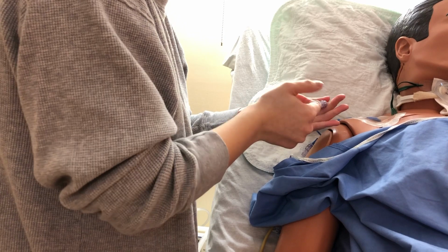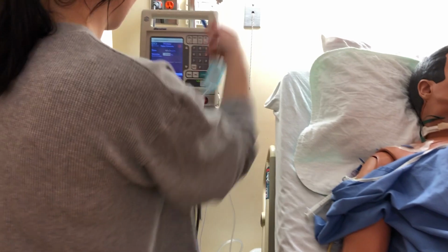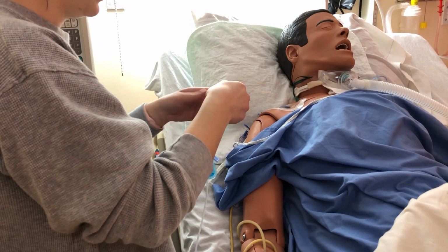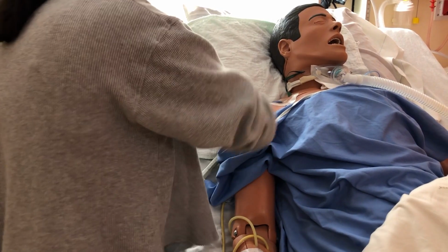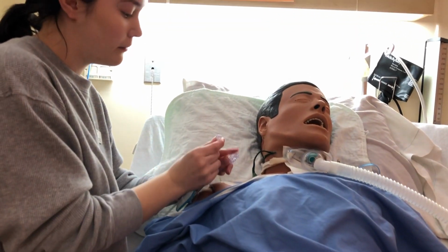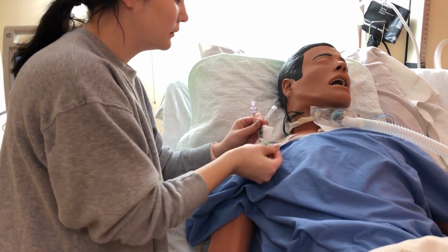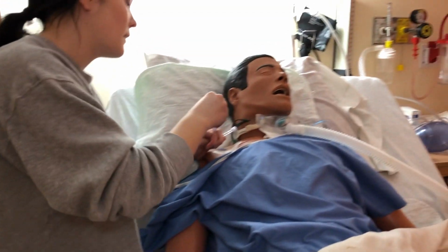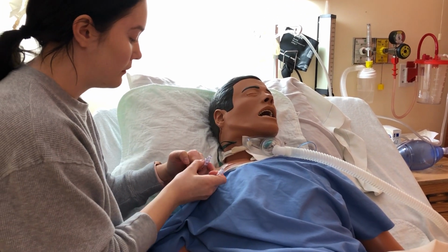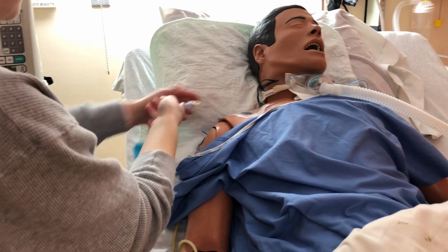Push, pause, push, pause. It's flushing with ease, and that's good. Okay, now I'm gonna get my tubing. And I'm just gonna re-swab. 30 seconds, dry for 15. And I have it connected.